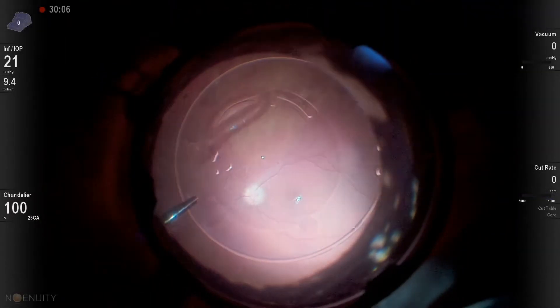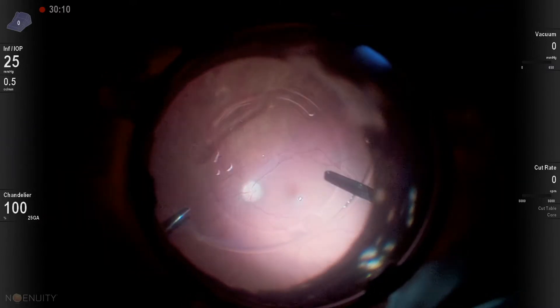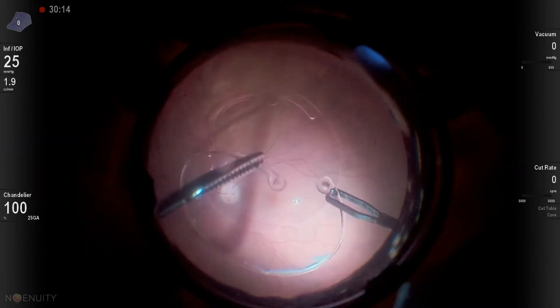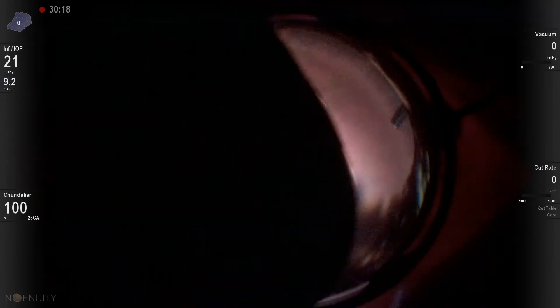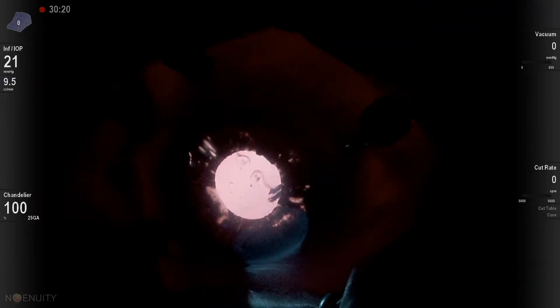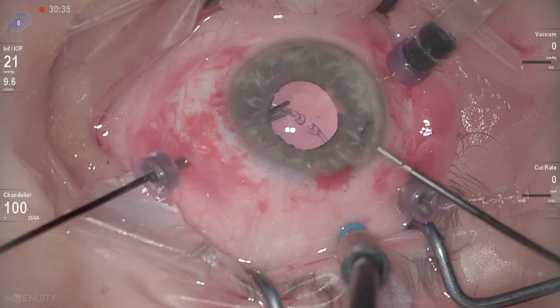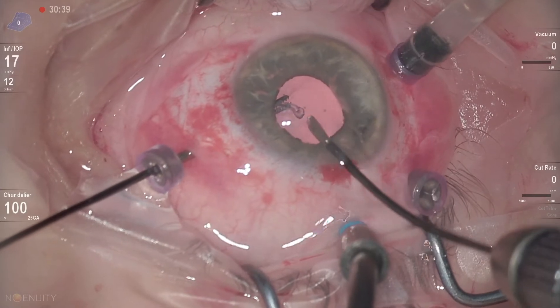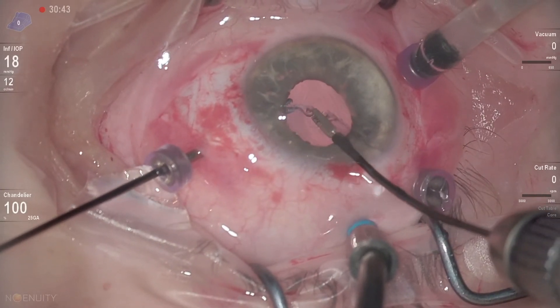Now I will place the CTR ring in a convenient position in order to extract it through the anterior chamber. I will switch to anterior segment mode and try to rotate the ring in a fashion that I believe will not engage or damage the peripheral retina.